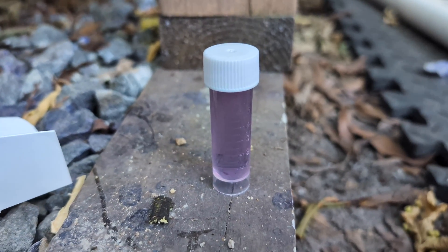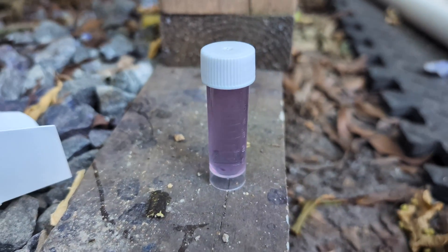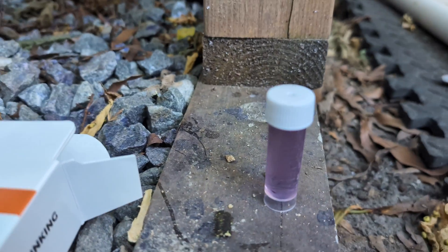I will come back and look at this in two days. If it's still purple, then we're good. If it turns yellow, then it's not good.